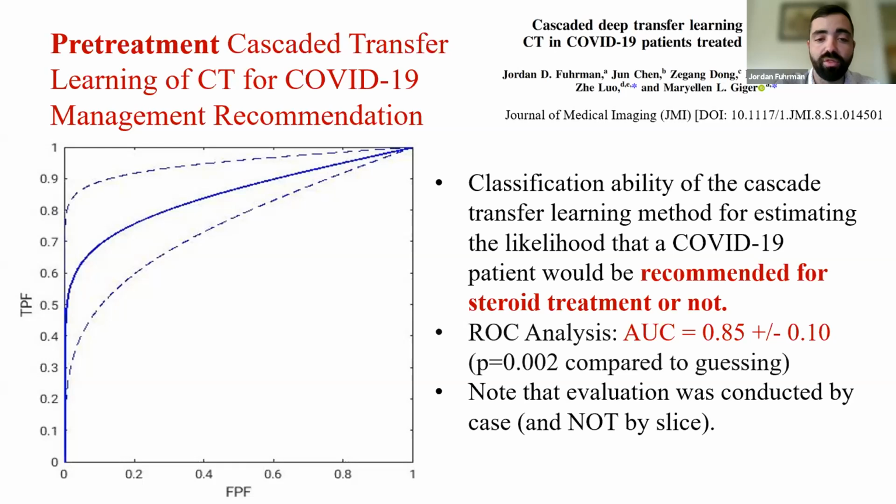Additionally, our model was trained entirely on imaging data, whereas the clinicians obviously could use non-imaging data in their decision as well, such as a patient's medical history or their demographic information or whatever else they needed.